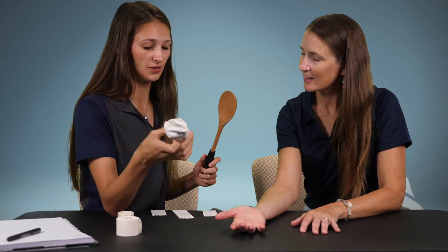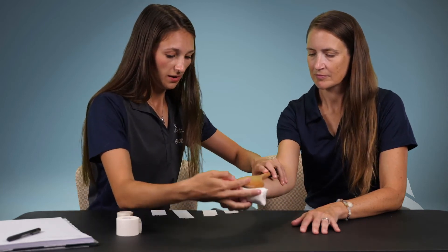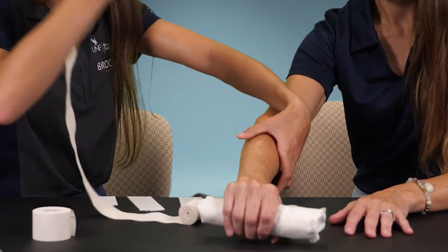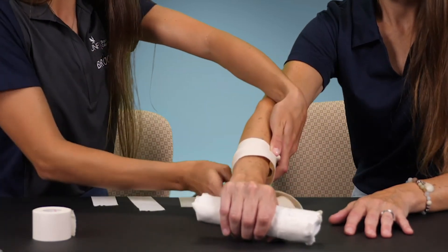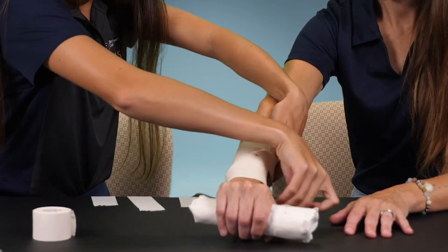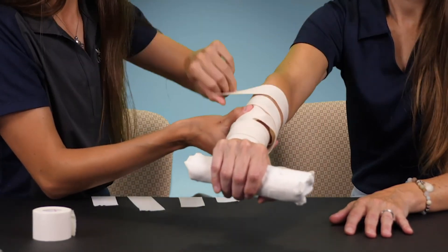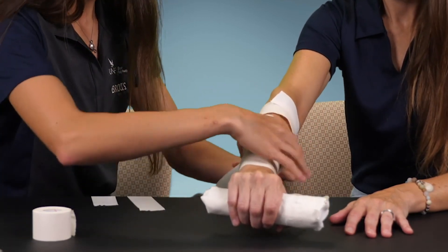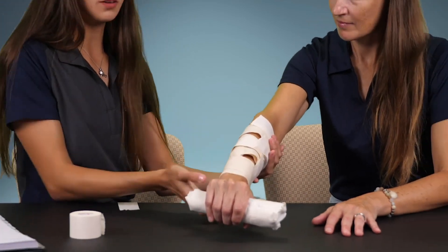I like to use — this is a pot holder — you can use anything, like a rolled-up t-shirt, especially if you're splinting the hand. I'd have them hold that; it makes it a bit more comfortable. Then you just wrap around it. You want it to be stable but not too tight — we don't want to cut off circulation. I'm just using a little wrap; it doesn't have to be pretty. It's a trauma situation — we just want it stable. Then you can use tape if you have some.